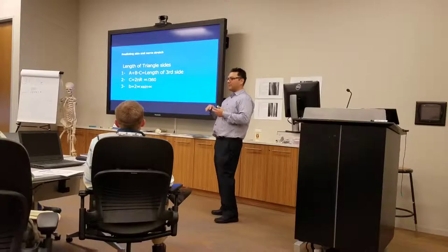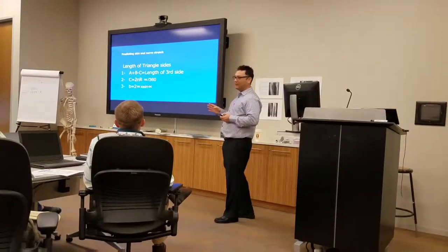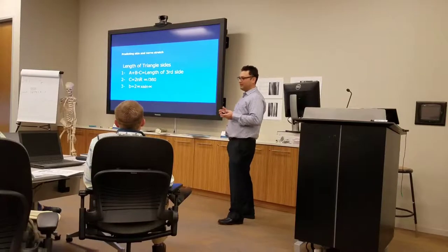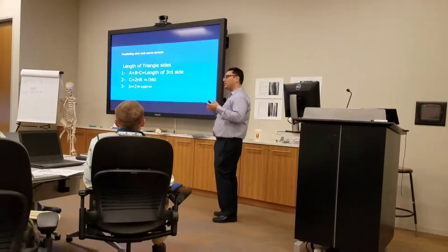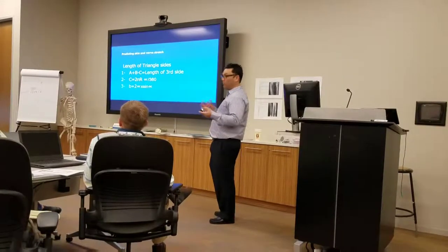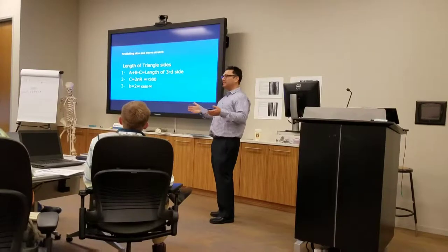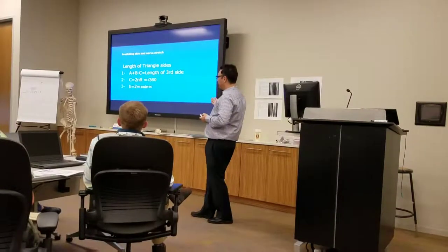Somebody tried to correct the hammer toe, for example, without taking out any wedges, and that toe will probably blanch and turn white. That's why you have to shorten. So the question is, how do I predict how much lengthening am I going to get if I do a correction? Or the other question you have to ask is, how much do I need to shorten to get this correction? There are different ways to do it.